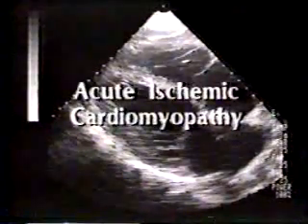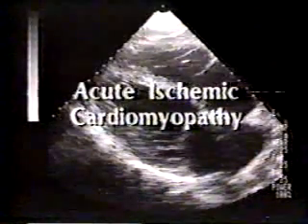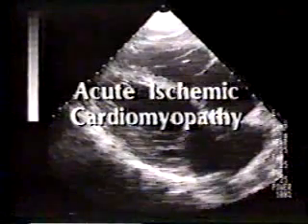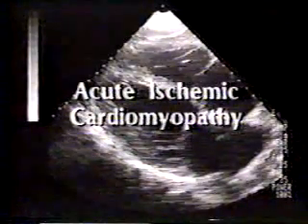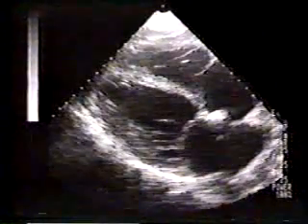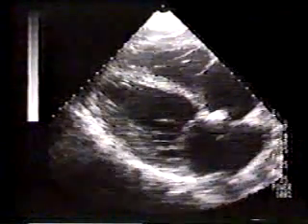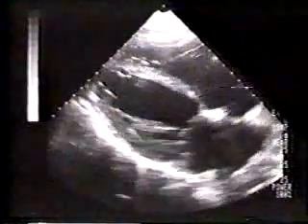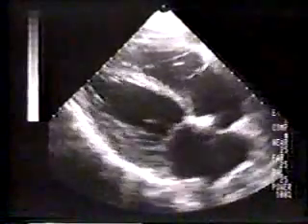This patient's first symptom of coronary artery disease was acute infarction, and he presented to us several hours into the infarct in a severe low-output state. Echocardiography demonstrated that this was due to massive left ventricular involvement, resulting in an acute ischemic cardiomyopathy. This is a subcostal four-chamber view.